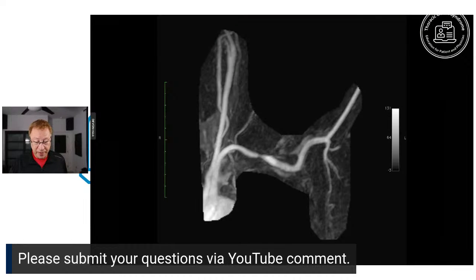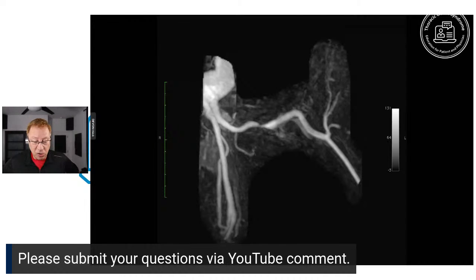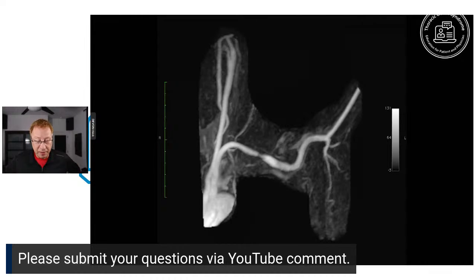Here's an example of a venogram, and you'll see a very, very narrow, tight space here caused by the rib and the clavicle coming together. You'll also see right after that compression, there's an aneurysm. So clearly MRI angiogram, widely accepted, can do this job. But what you'll also notice in this picture is you don't know what's causing that compression. Everything else is made black so that we get the best arteriogram, okay?